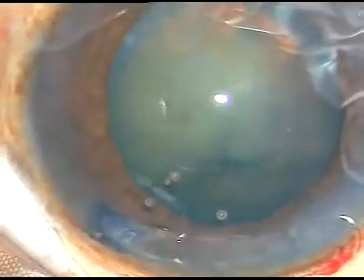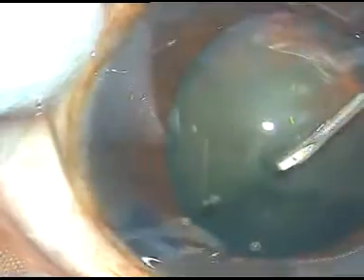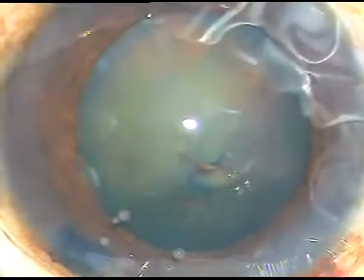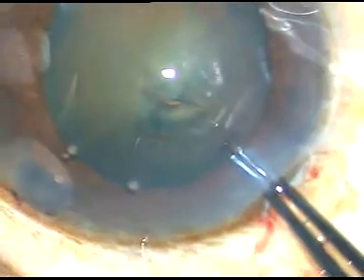Now a bent cystitome is introduced and the capsule is incised and a capsular tag is made in this way. Now see how I do Rhexis with Utrata forceps. As I rest and press the anterior lip of the incision, it doesn't leak.